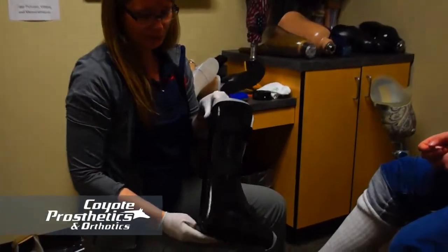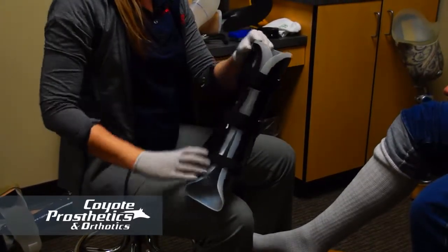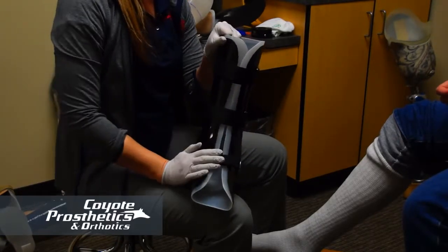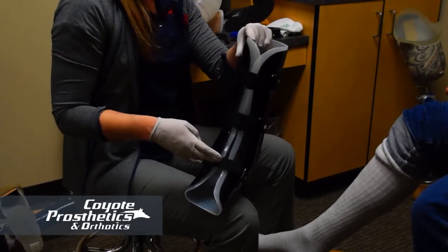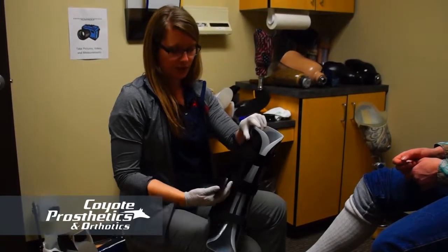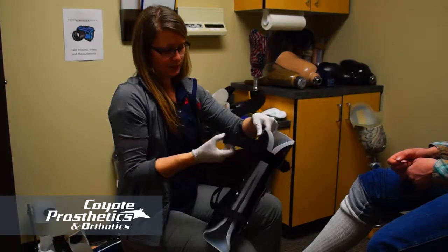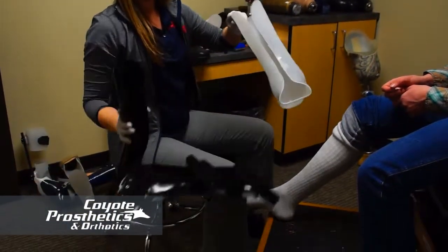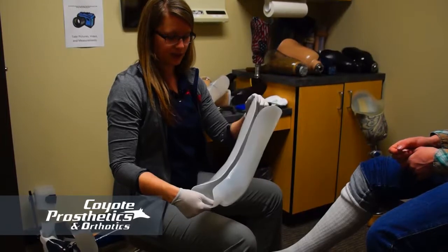This is the Boise bivalve brace, which is a little different than the others. It has three Velcro straps. When you take them off, fasten them back on themselves — that way they don't get tangled up in each other, they won't collect lint, carpet, or hair, and your Velcro will last longer. This one opens from the bottom with a bivalve design and has a flexible inner boot. It's pretty comfortable and helps protect the skin a bit more.